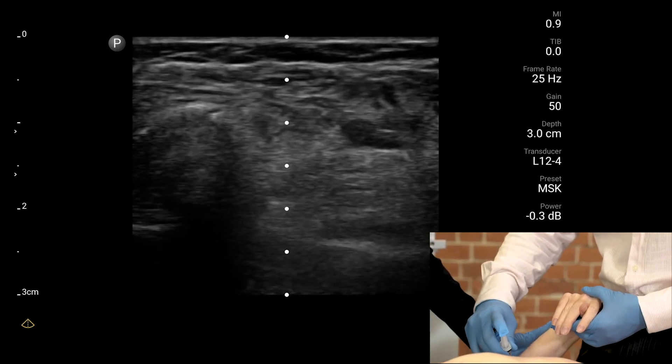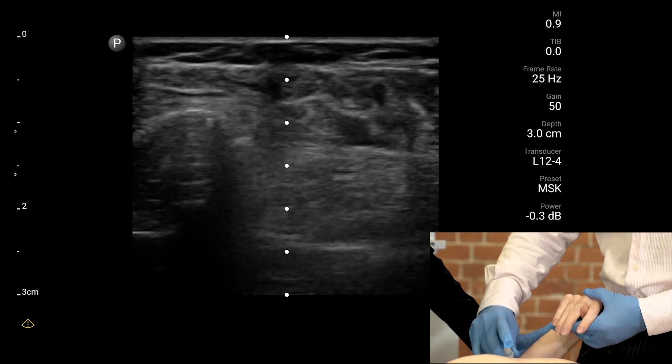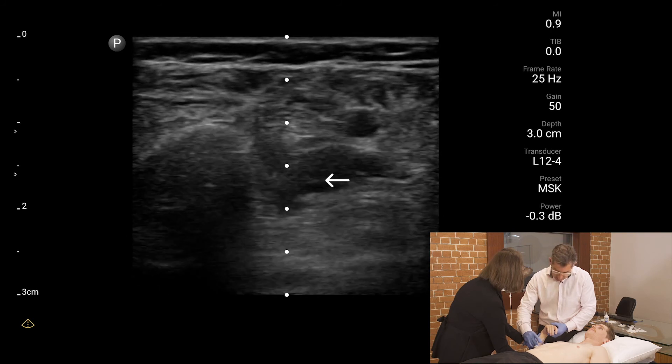Hold still. Scratch now. There he is. You can see the tissue being distended by the toxin as it works its way in.